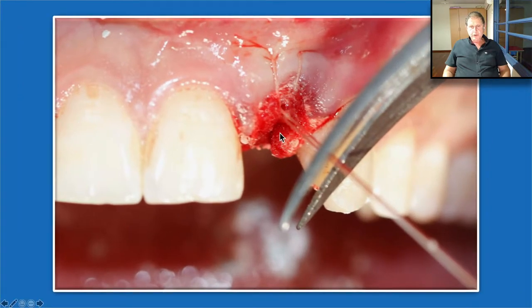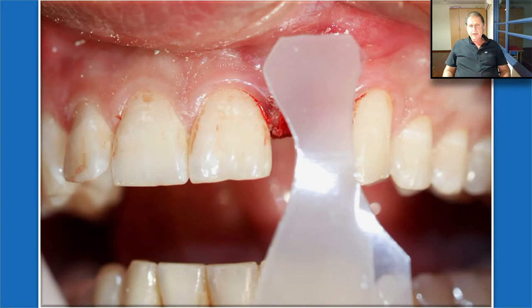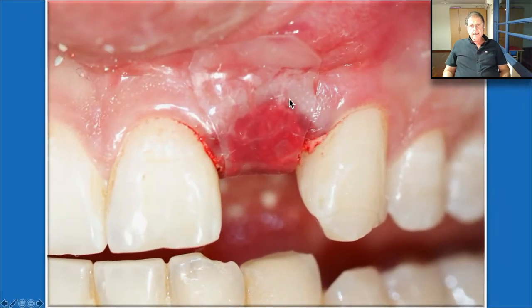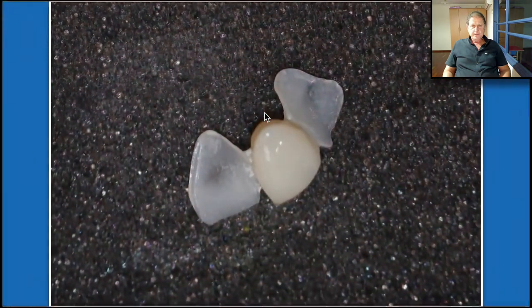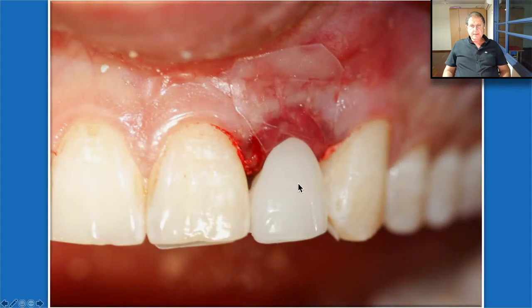The collagen sponge needs to be secured very well — we go through it buccally and palatally and secure it. And above it, we just place the Oraid. Nowadays, we don't use the collagen sponge — we just use the Oraid. In this case, because we used a provisional Maryland bridge that kept the Oraid in place, we didn't need to suture. Otherwise, we need to secure it by sutures. This is the provisional Maryland bridge — we bond it to the tooth and it keeps the Oraid in place.